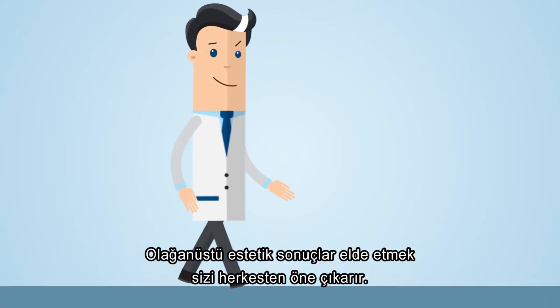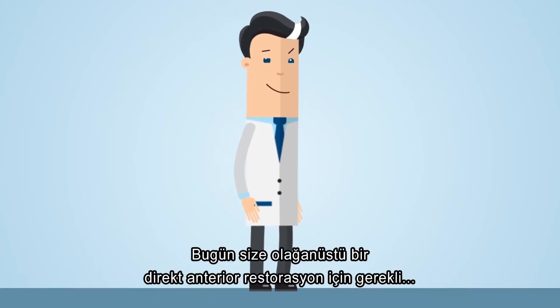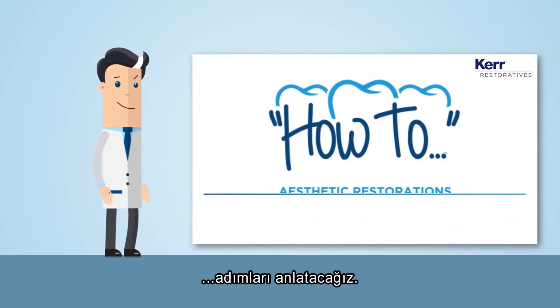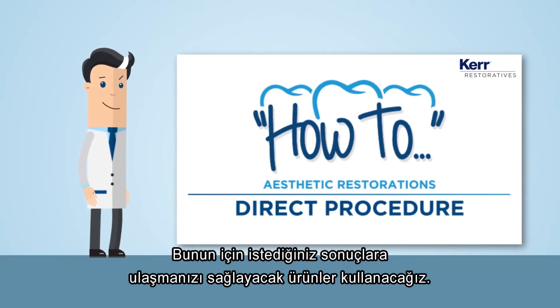Getting great aesthetic results is what sets you apart from everyone else. Today we're going to take you through the steps for an outstanding anterior direct restoration, using products that can give you the results you want.